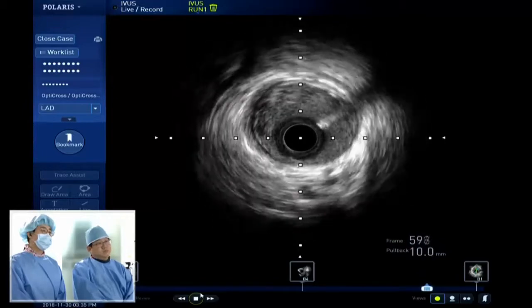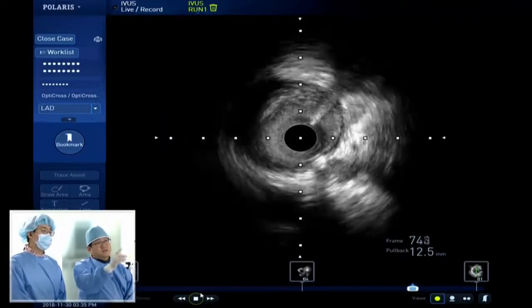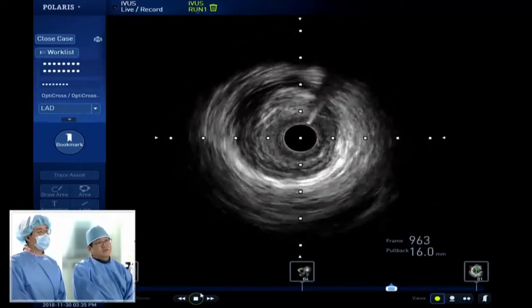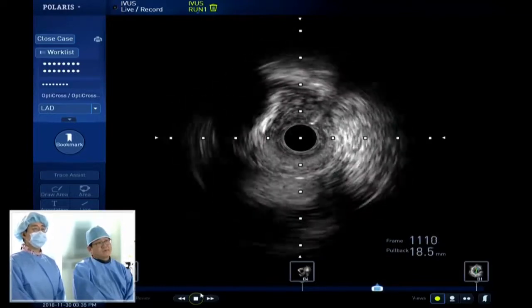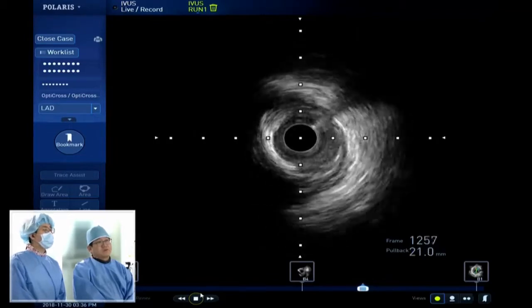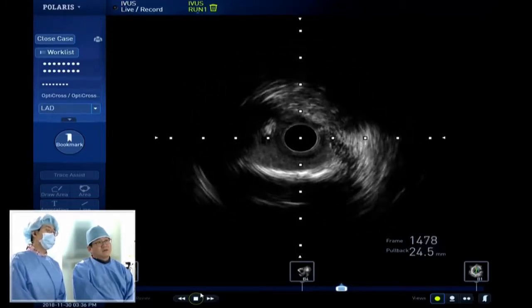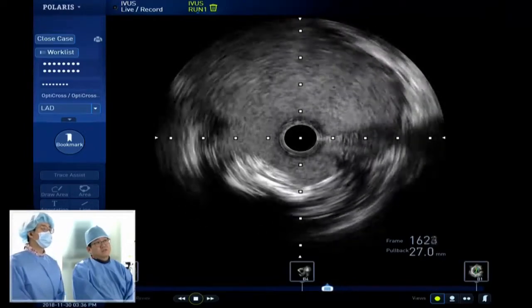Distal to the aneurysm side? Yes, right. The tight stenosis starts here. Very tight stenosis. And then you can see the huge aneurysm. Which o'clock? Not just yet, a moment. 12 o'clock maybe. Big vessel, right? Almost 4 or something. Okay, here. Stop, please.